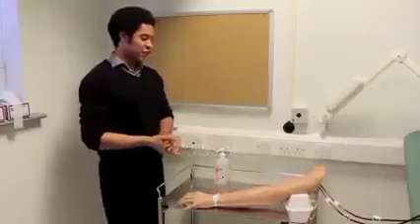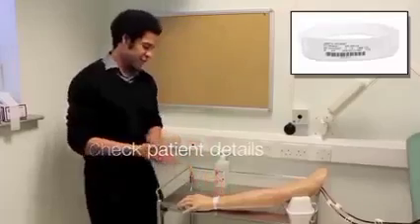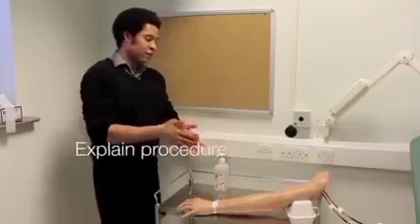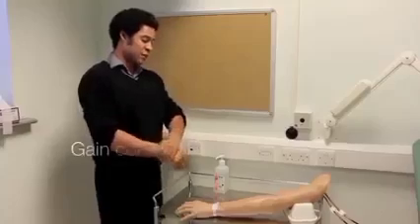Hello, I'm your medical student. Could I check your name please? And what's your date of birth? What I've been asked to do today is to come and take some blood from you. That will involve putting a small needle into one of your veins and it will feel like a sharp scratch. Would that be okay?